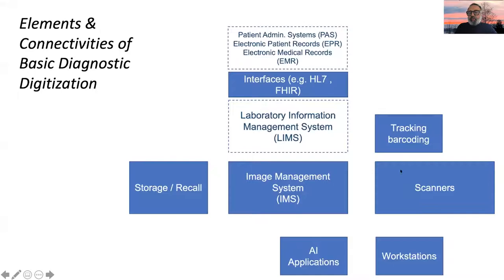You need to know how you're going to generate your images, how you go into a storage and being able to recall them, the LIMS that is going to be able to make the most of those images brought into pathologist workstations, and obviously with the possibility of bringing some applications, and needless to say, the links with the rest of the information systems that we have in our hospitals, and that would make the whole exercise as meaningful as possible. Getting these pieces individually is a procurement exercise.